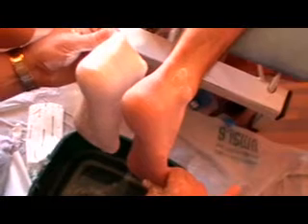A final step is to put the foot back in its neutral position and compare the shape of your cast to the shape of your patient's foot. Ensure to look at the sole of the heel and the ball of the foot, and look at that on your cast as well. If it looks the same, it's a good cast. If the cast looks completely different, you need to recast the foot again.